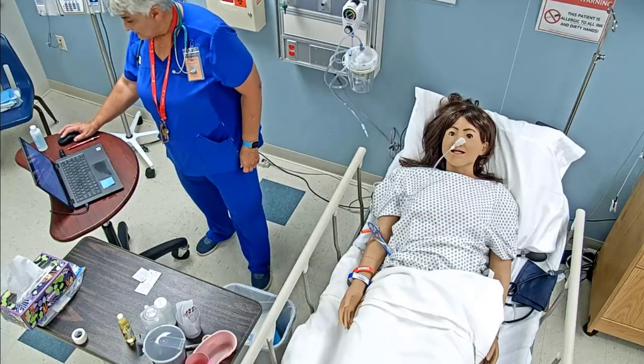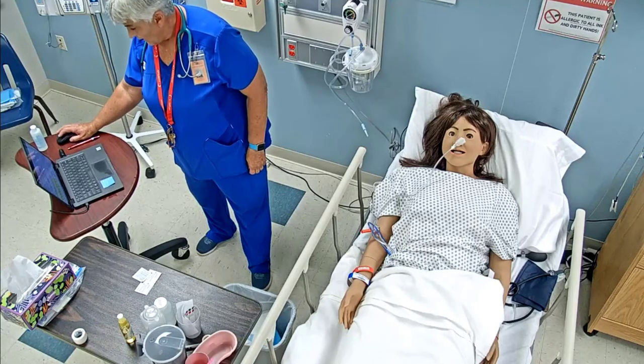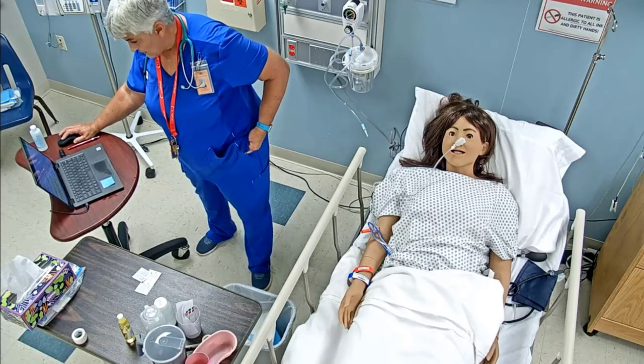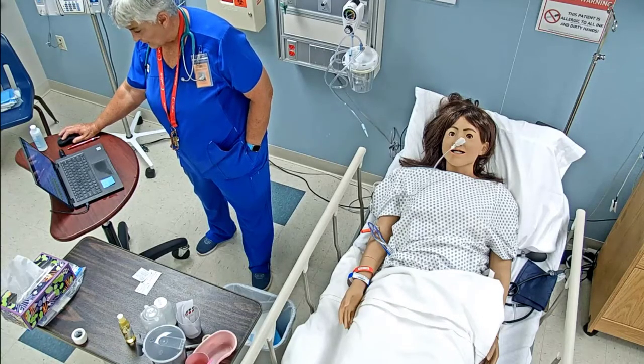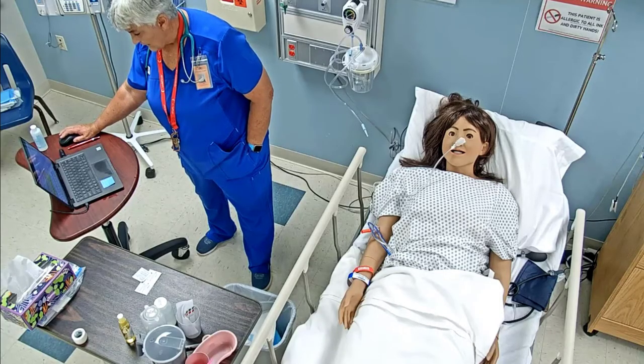Okay, we are back at the nurses station, and I'm going to be looking at my orders again. So again, I have Anna Taylor, date of birth 4/24/1991, no known drug allergies, uncontrolled diabetes 2, abscess of abdomen and right forearm. And I'm going to look at my new order that says to discontinue the NG. And so we will make sure that we have everything that we need.